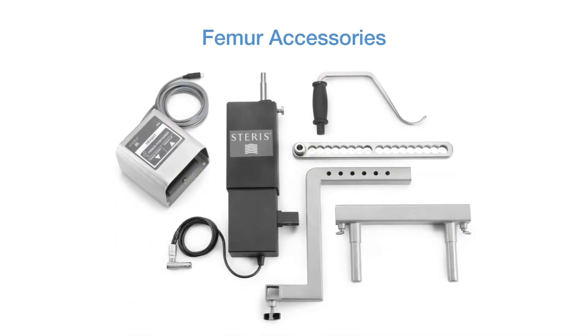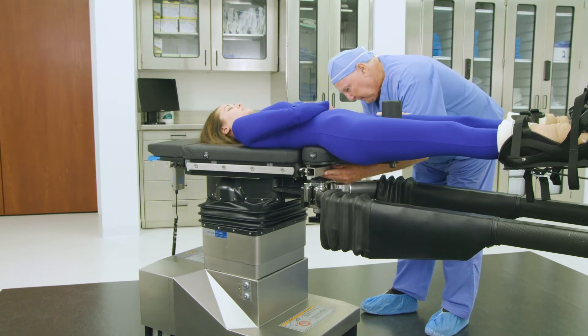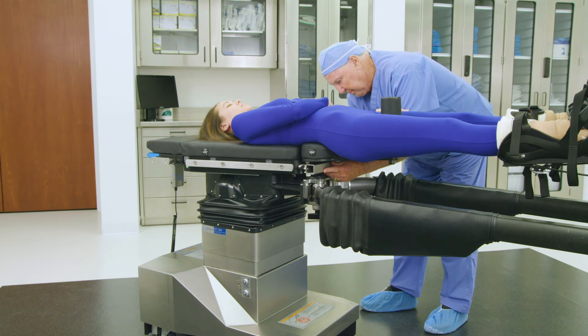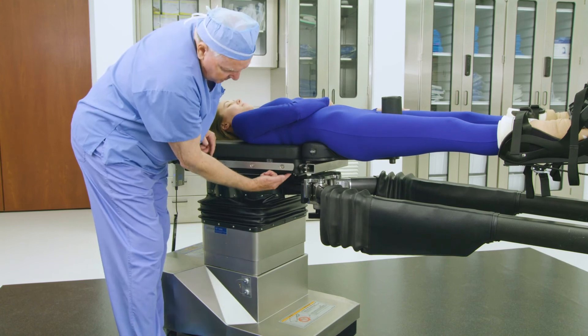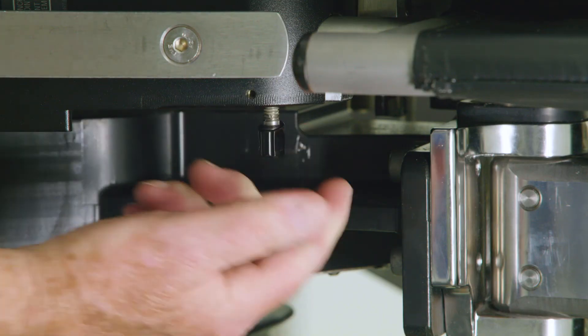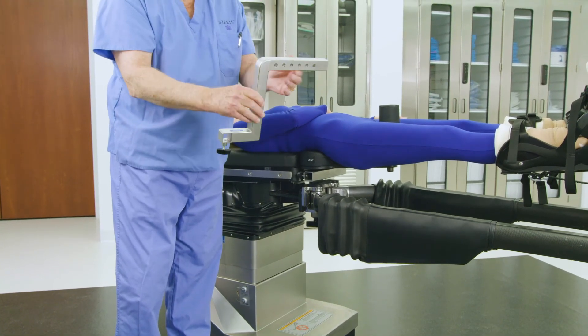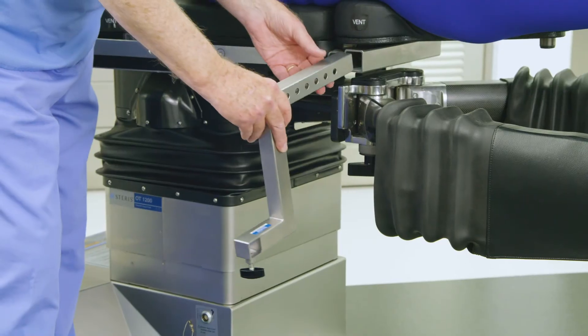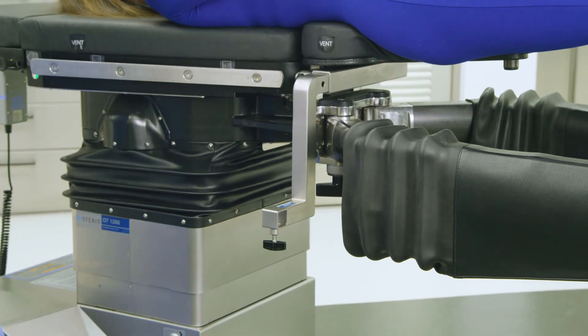For anterior approach total hip arthroplasties, a femur lift assembly is employed to position and articulate the operative femur. The setup involves six components. Select the femur drive table attachment and align its two plungers with the mating holes just above the abductor spar rosettes. Ensure the locked T-handles are in the fully open position, then push the femur drive table attachment into the mating holes until the posts bottom out. Tighten the T-handles to secure. Select the femur drive S-bracket attachment and insert it into the femur drive table attachment on the operative side. There is no need to adjust or tighten the S-bracket at this time.